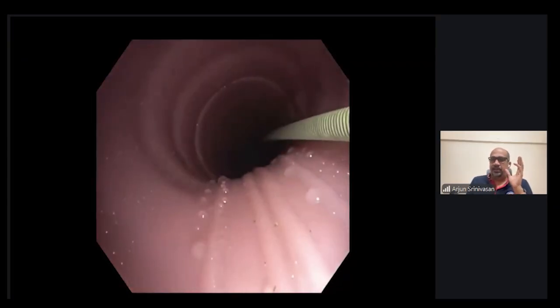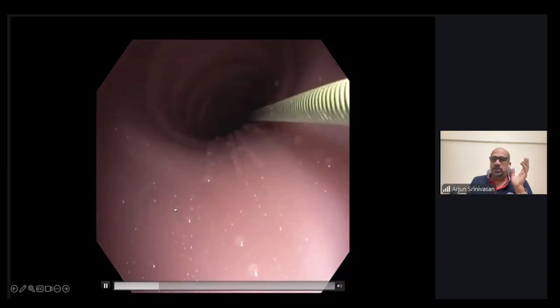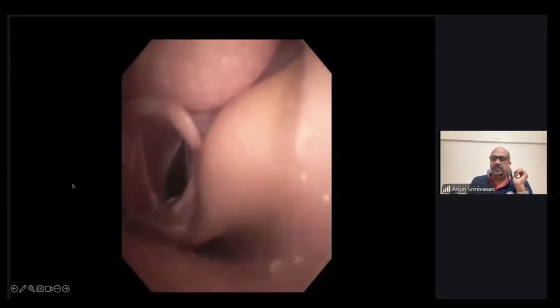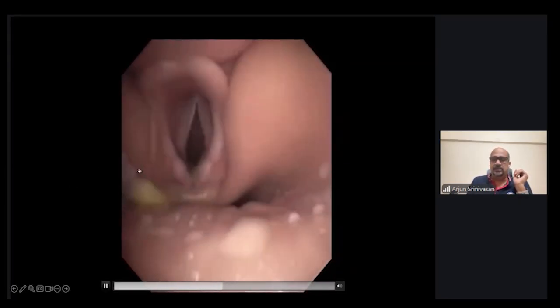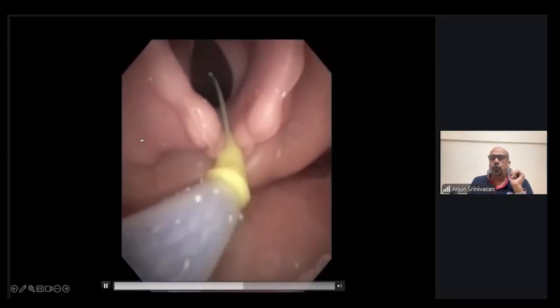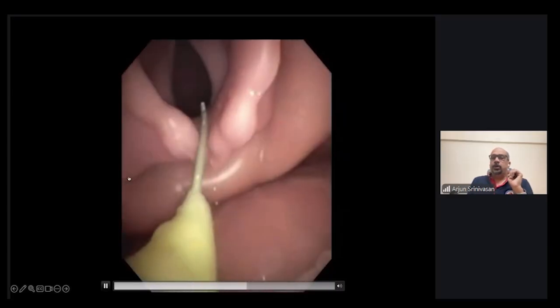I'm stressing this part, that it has got to be a stiff guide wire, time and again, because of what you're going to see next. Once the guide wire is placed, you're threading the stent. This is why it is extremely important. You can see that this is about 6 mm at least, and it is extremely stiff. The stent deploying apparatus is difficult unless you have a very stiff guide wire and McGill's forceps around. And imagine this patient is conscious and breathing and also has a tracheal stenosis or a stricture, for which you are placing the stent, and it is quite difficult to get beyond the arytenoid, even with a stiff guide wire.